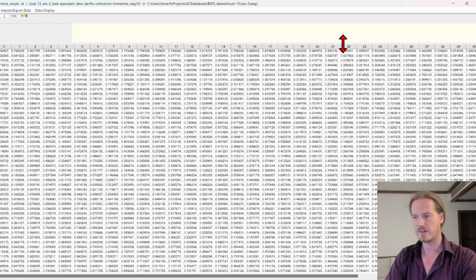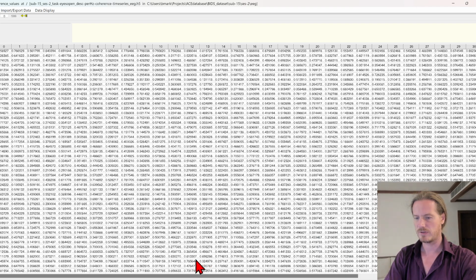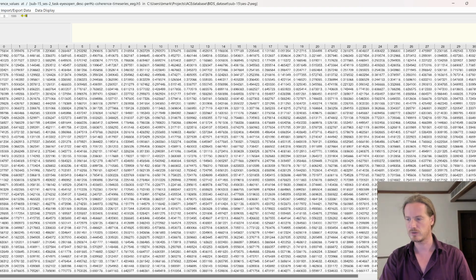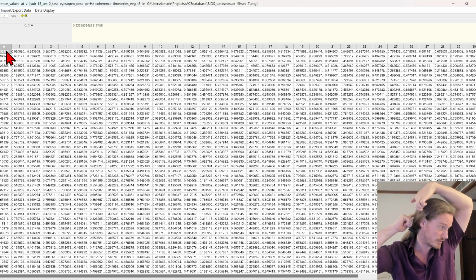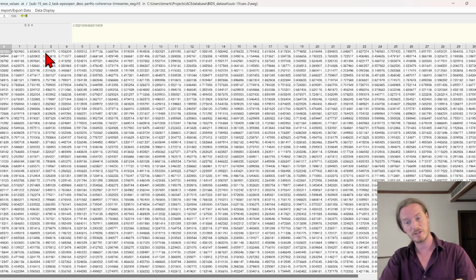And in this direction, you will see we have 40 columns. And what does that mean? That corresponds to the whole frequency range that we're looking at, from 1 to 40 hertz. And for every hertz, for 1 hertz and for 2 hertz and for 3 hertz, etc., we are saving the coherence. So not just only for the alpha range, but for every individual frequency. So if we go to the top of this chart here, earlier we saw that the first position was, I think, O2, which is over here, and I think P8, which is over here. So the coherence between those two positions is stored over here, and first it is on 1 hertz, and then 2 hertz, and then 3 hertz, and then 4 hertz. But it goes further. So we have a tremendous amount of information here.